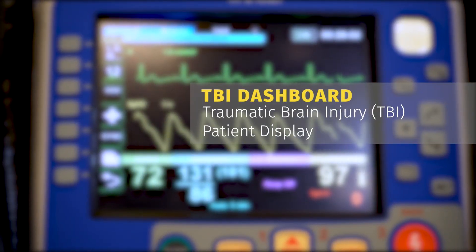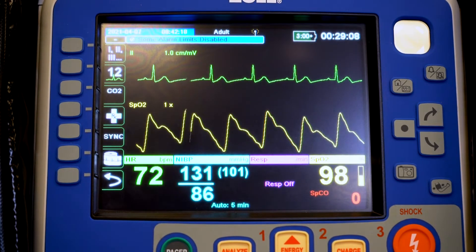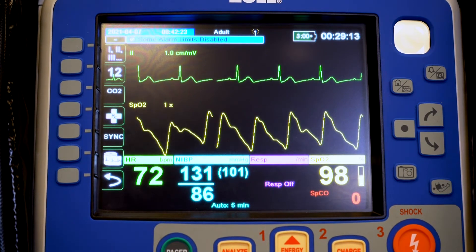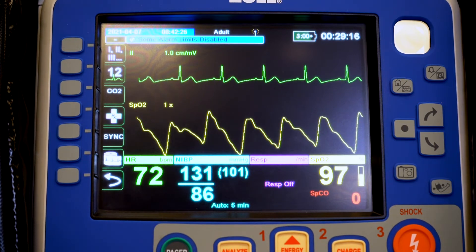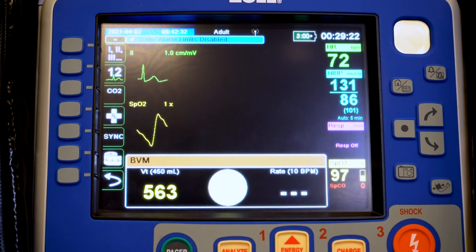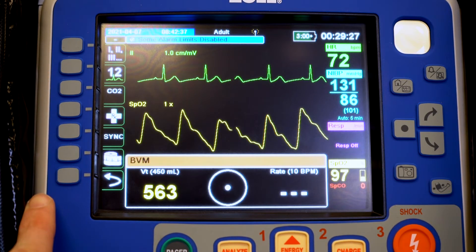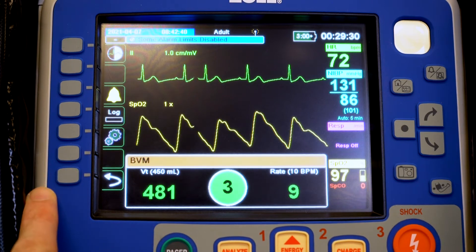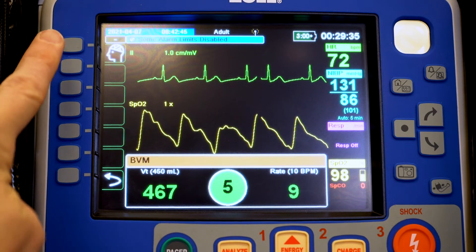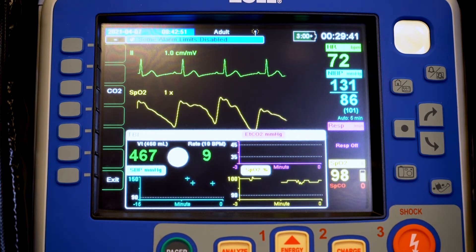Now we're going to demonstrate how we get the TBI dashboard and what it has to offer. With our real-time BVM feedback cable attached to our patient on an ET tube or supraglottic airway like our iGel, we'll be bagging and getting real-time BVM feedback immediately. To get to the TBI dashboard there's some buttonology: on the left-hand side press the back arrow once and then twice. You may have stumbled upon this feature, but the TBI dashboard is selected here — select the head icon and the TBI dashboard pops up.